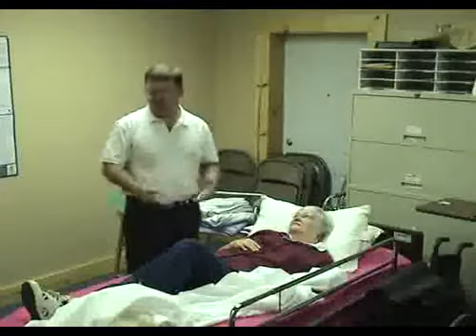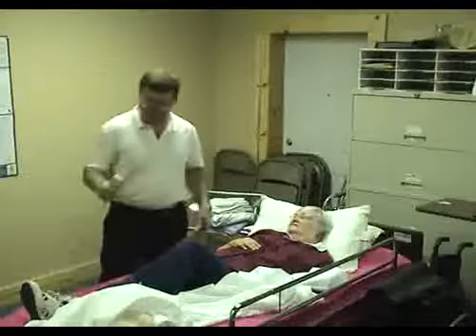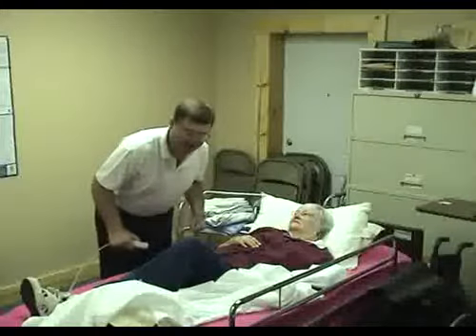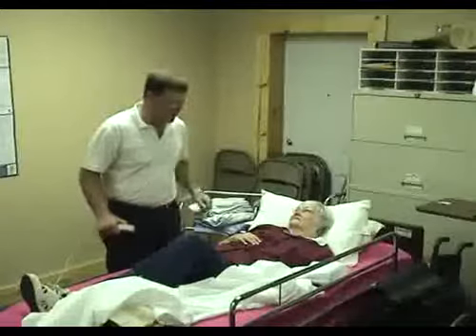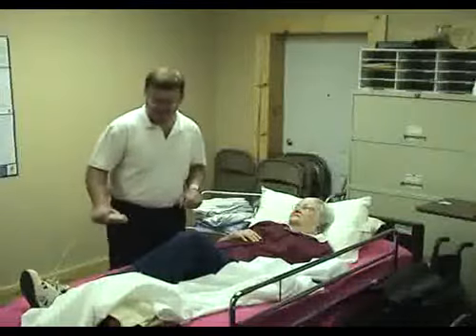You know, I've already elevated this bed here a little bit, but if we were actually giving you a bed bath, you'd be a lot higher. That way I'm not like this the whole time, because when we get done, my back would be on fire, just from holding that position for such a long time.